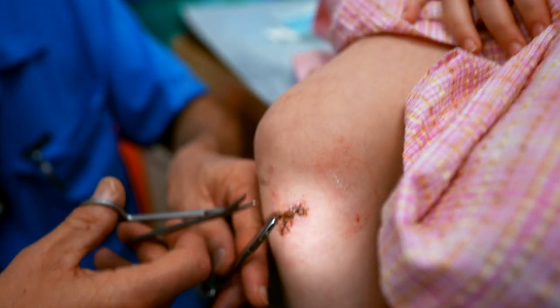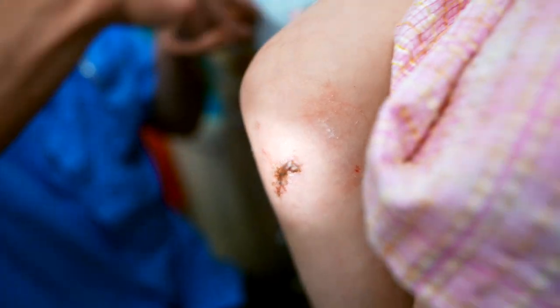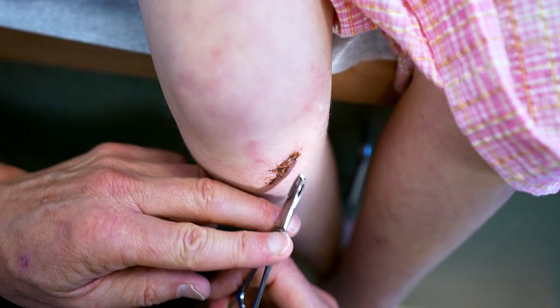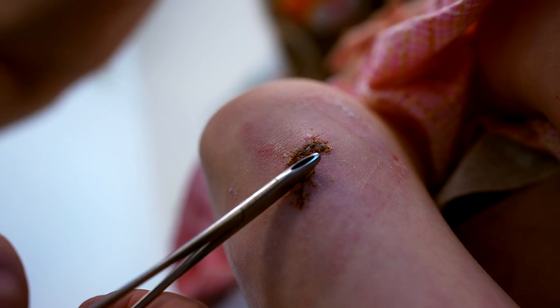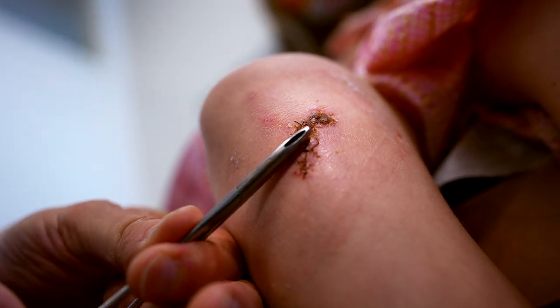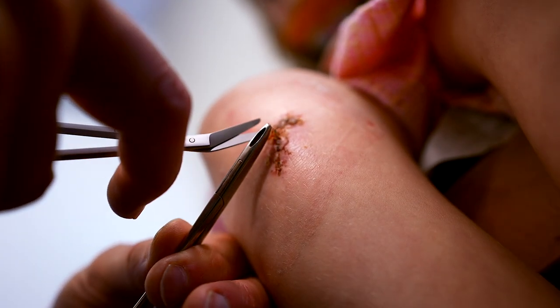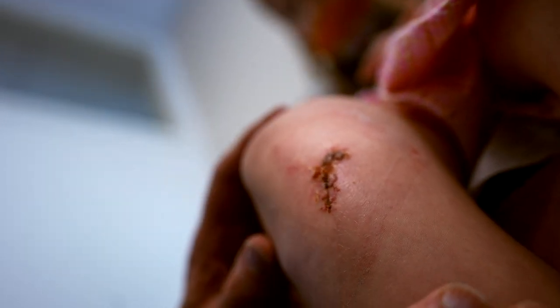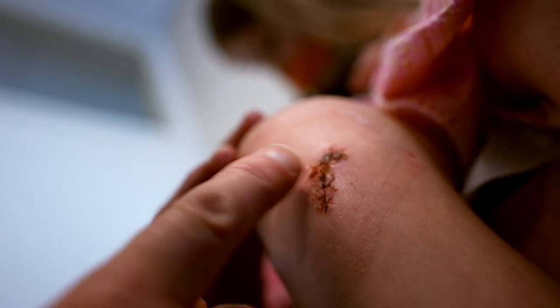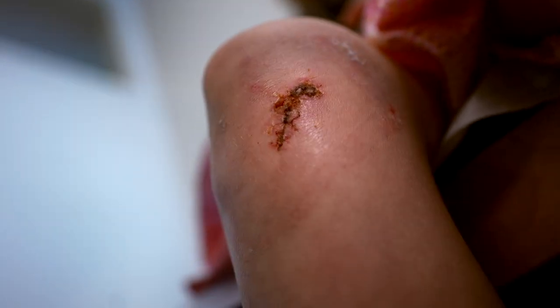That's amazing. We should give you a light holding prize. Here, I'll let you hold — just don't get too close. That's perfect if you can still see. I'm gonna get a little strip across there. Is that the last one? It was the last one. One, two, three, four, five, six, seven. And there was one that got two tangled together. So I think it is eight.